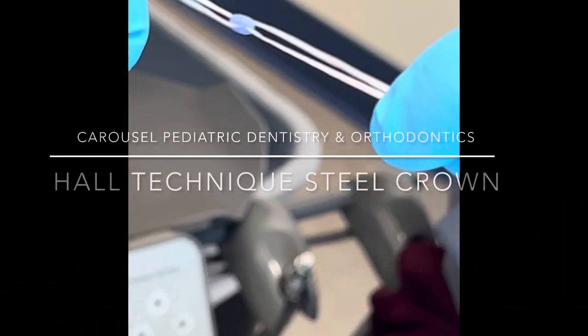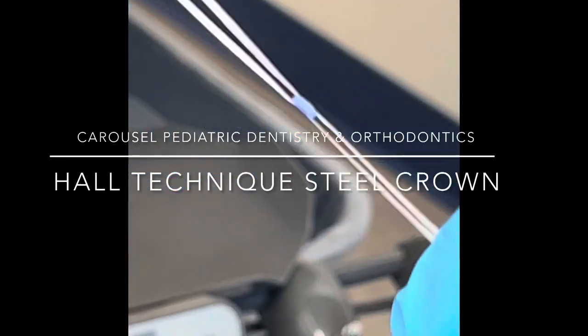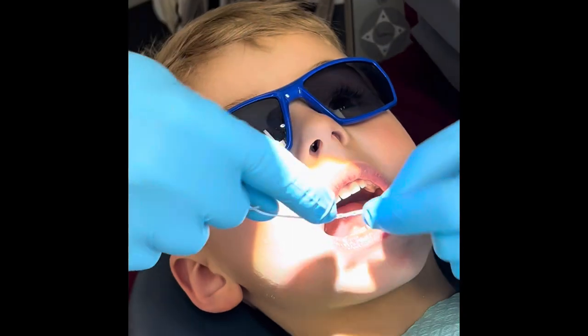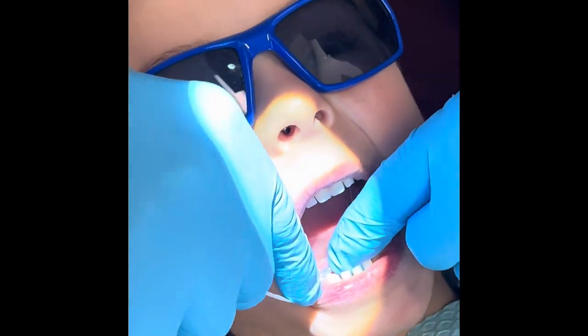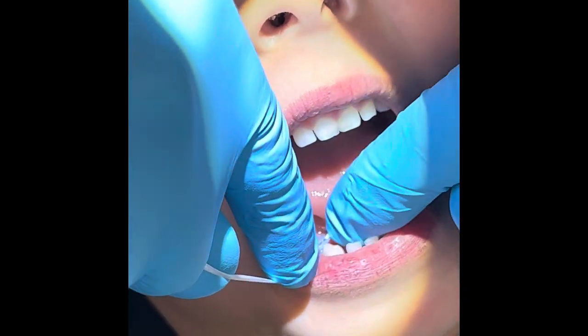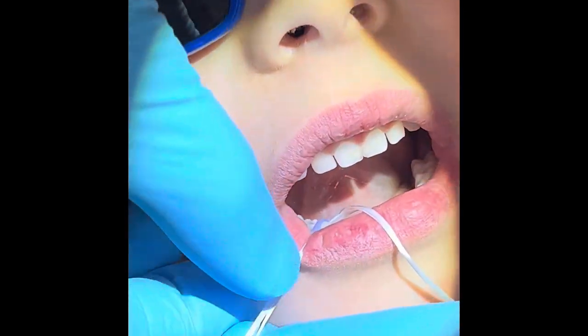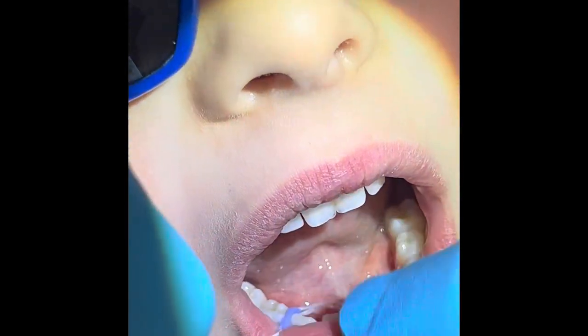You see that James? So that's a little rubber band, and this is just two pieces of floss, just like normal. What I'm gonna do is just floss it between your teeth, okay? It's just a big push — open really big — and we go like this. Done! You did so good.